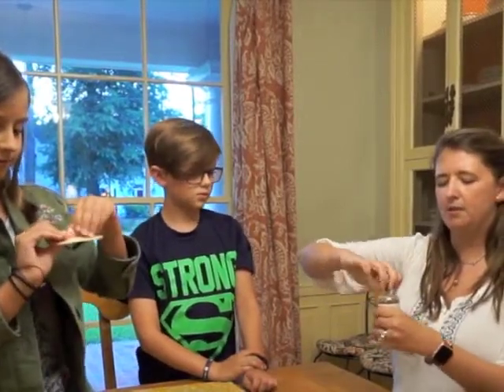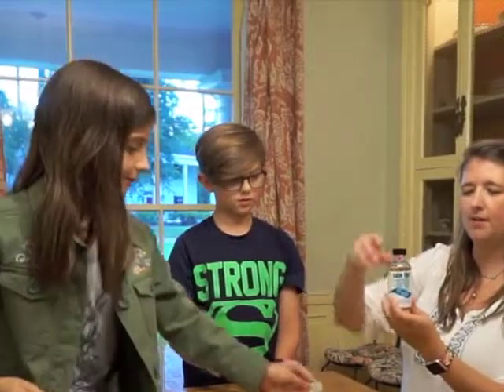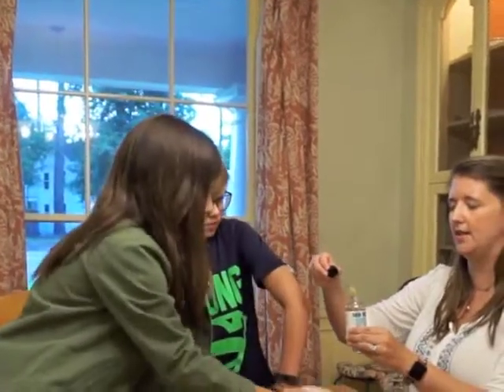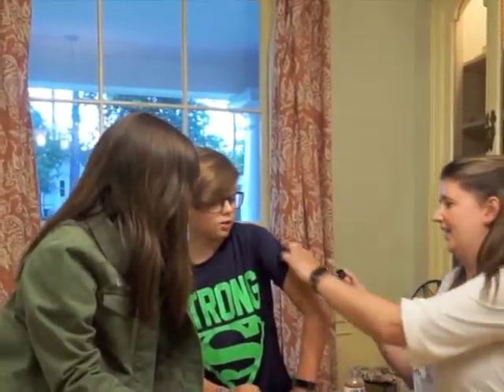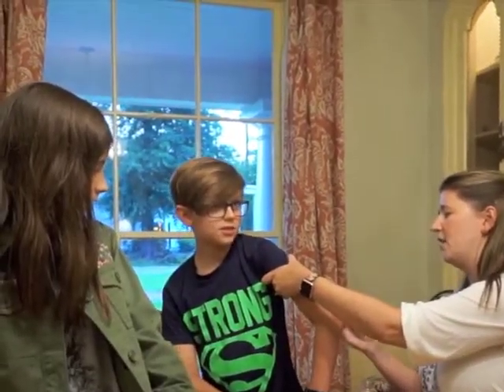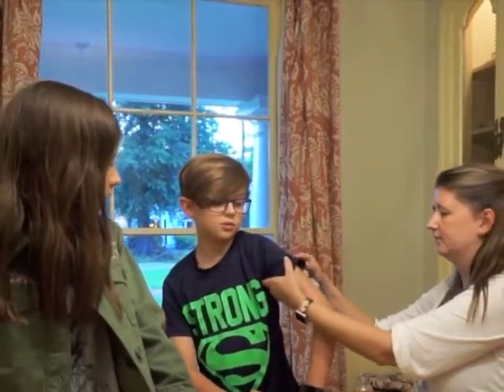We also use Skin Tac to help it stick — you can order this on Amazon. The Skin Tac is incredibly sticky, and we learned that the hard way. I put a layer around just on the adhesive.